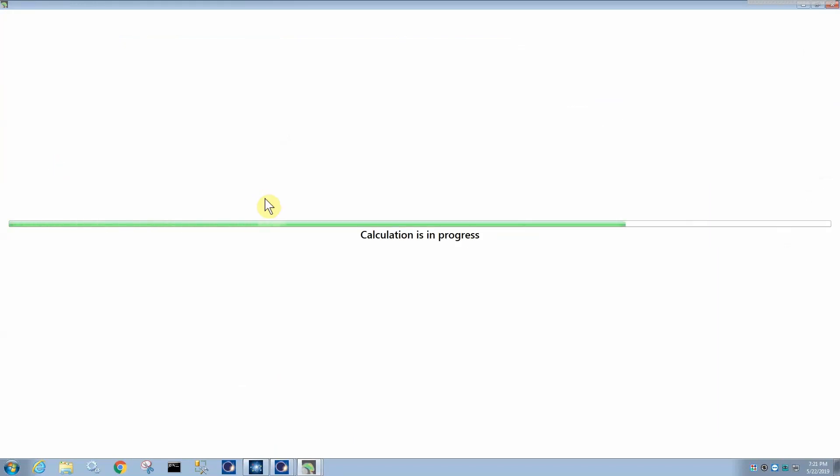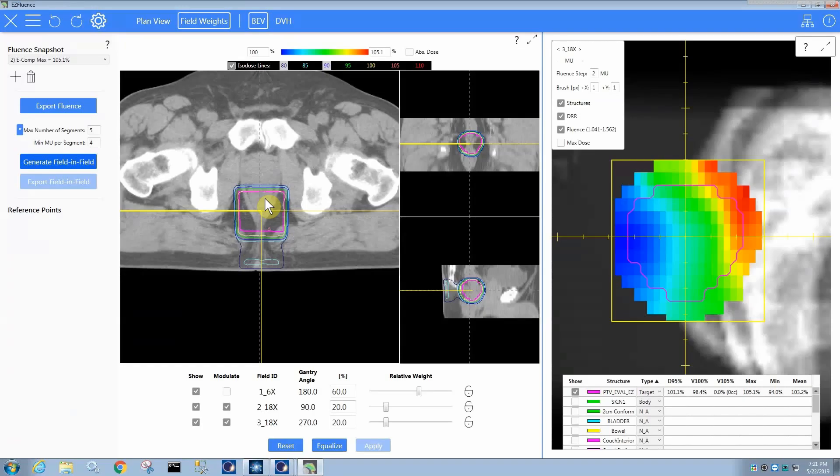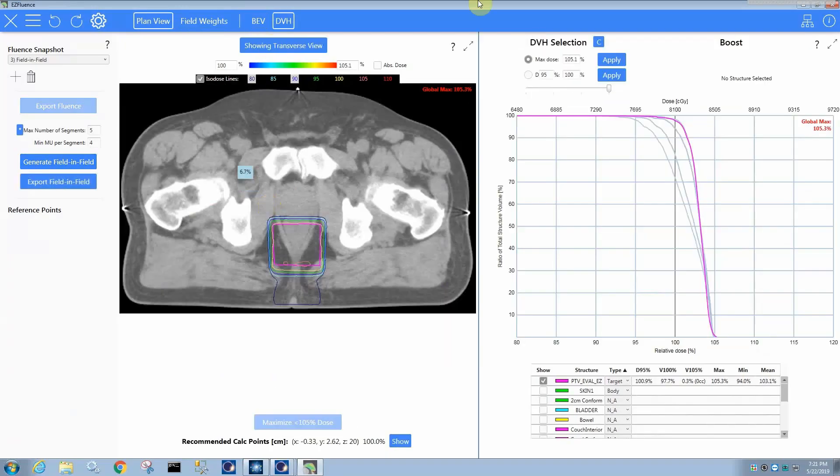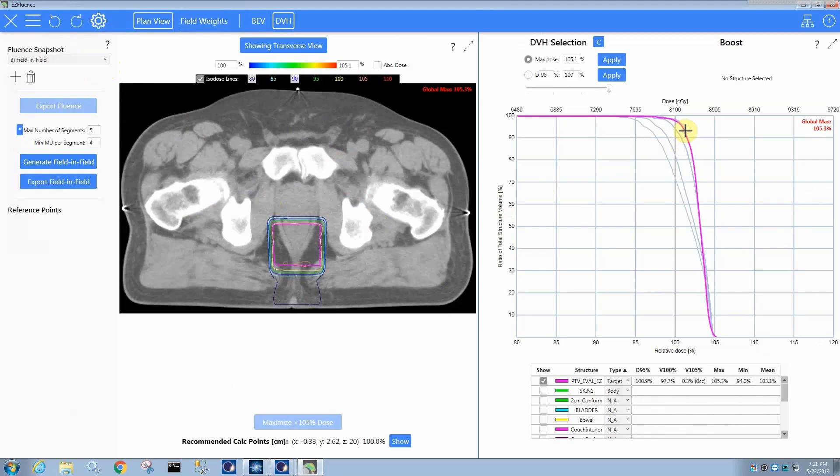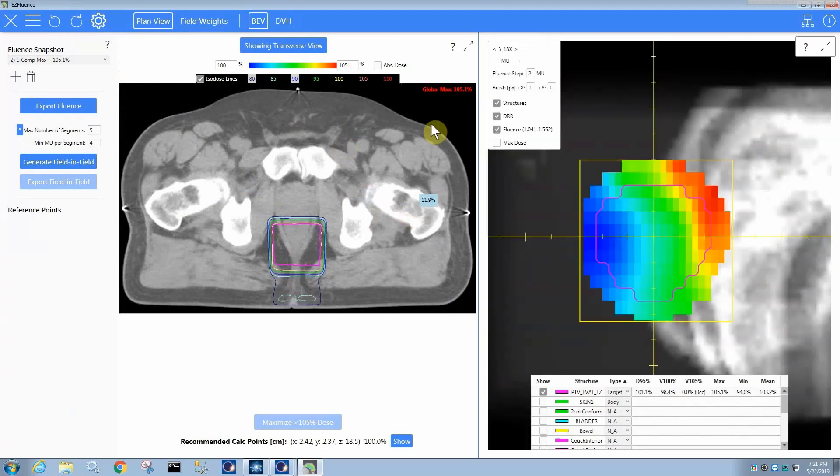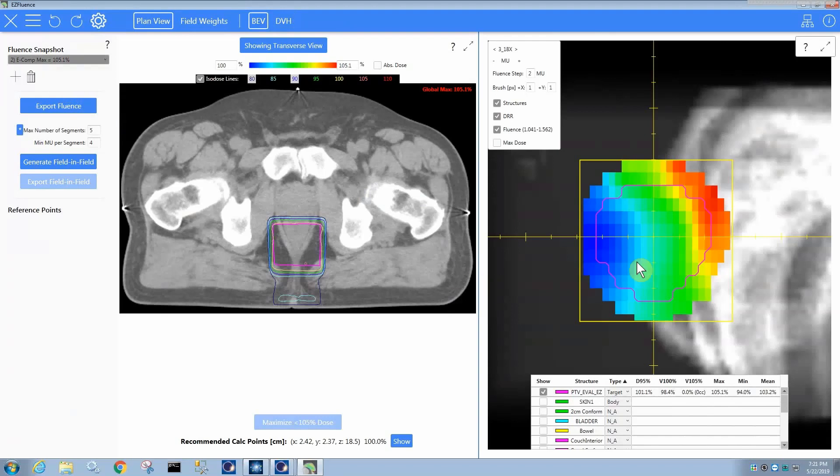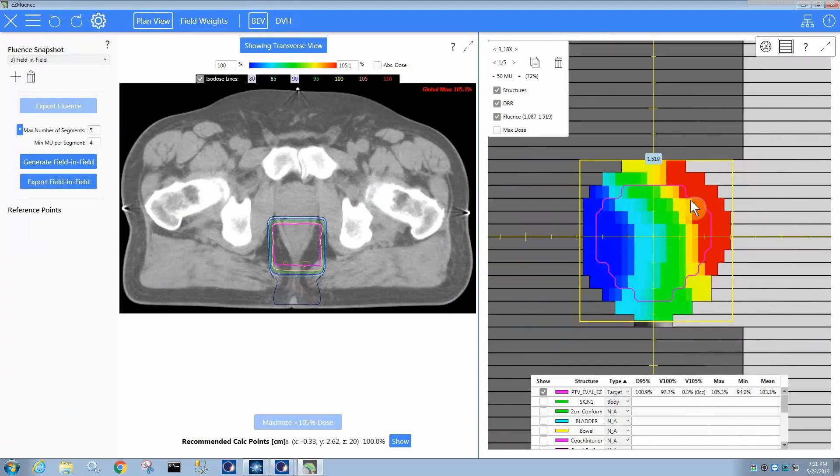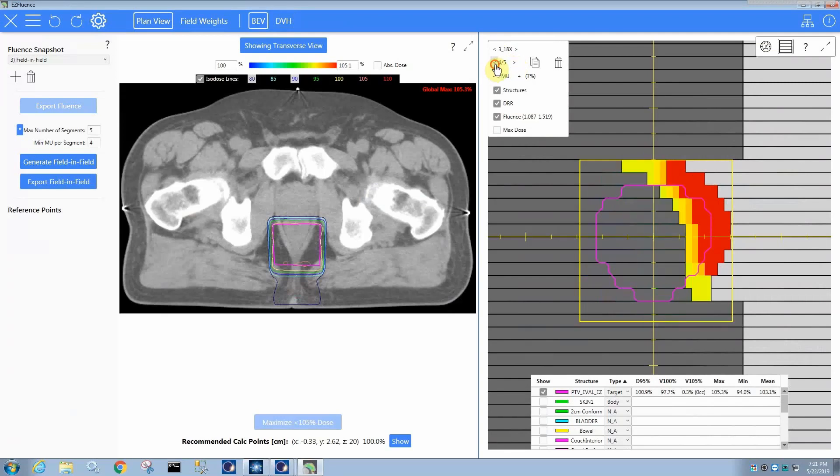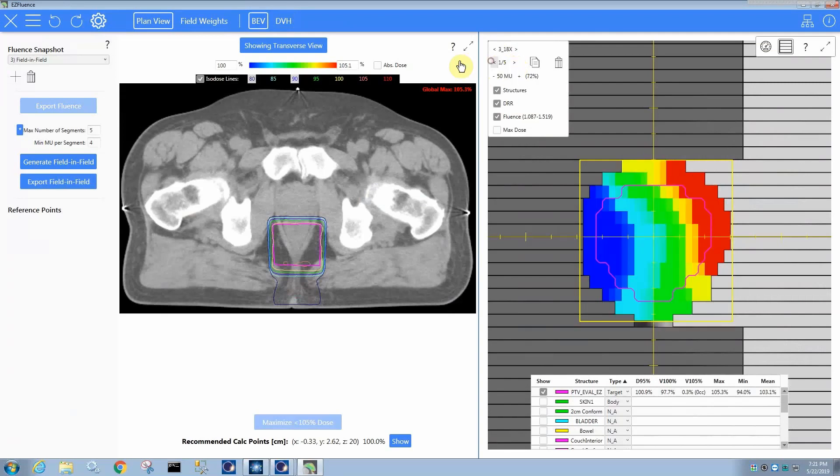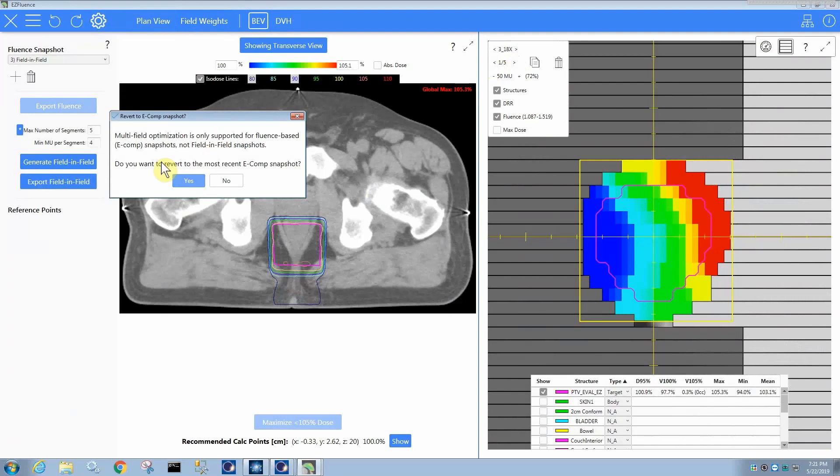And pretty quickly, we're going to have a field-in-field plan that delivers a wedge-like fluence pattern such that you have a dose distribution. I'm going between now my e-comp and my field-in-field. You can see that it's practically identical DVH between the two, very slight differences. And if I come down to my field-in-field, the effective fluence pattern of this field-in-field is very similar to my e-comp. And of course it looks like an EDW, doesn't it?